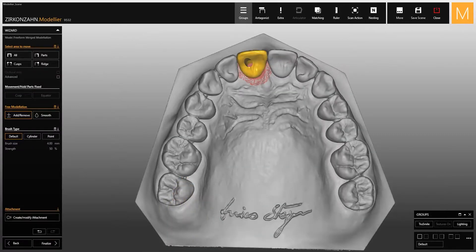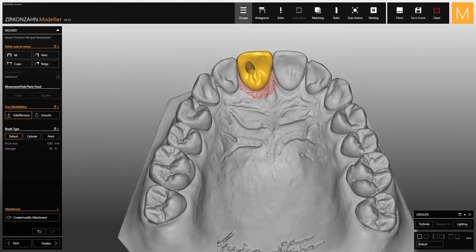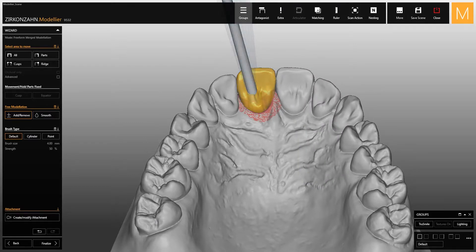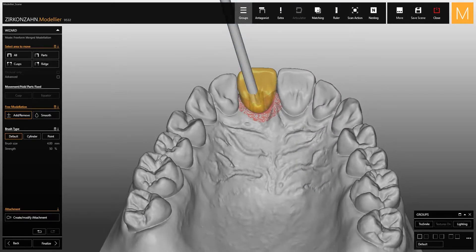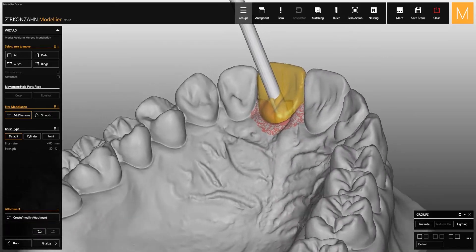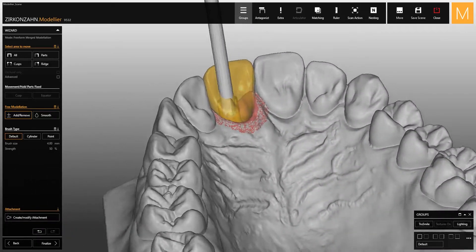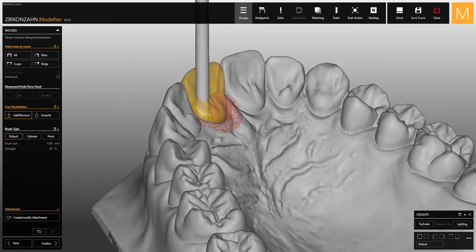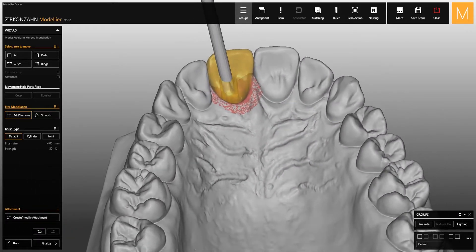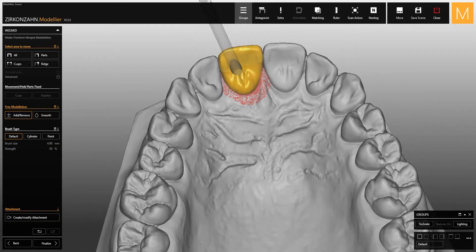Thanks to these new functions it is possible to create screw channels without any aesthetic or functional problems caused by a vestibular orientation. Watch the upcoming videos on the new version of Zirconzen and Meditlier to discover all the features of the software.